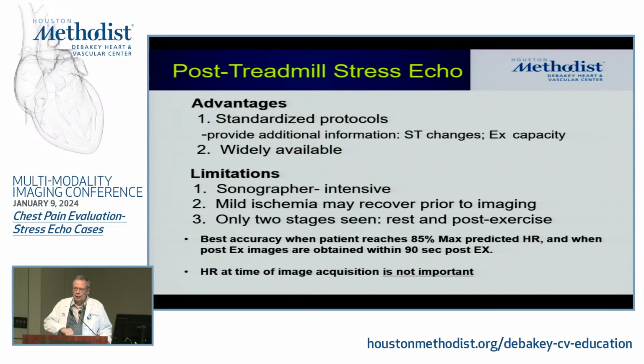Once the patient stops and lays down, many patients will slow down nicely, and you capture at a heart rate of 100 or 90, and if it's positive, you can see some nice positive changes. That heart rate is of no importance. It's what they reached when they were exercising. Okay, so that's a very important point to remember.